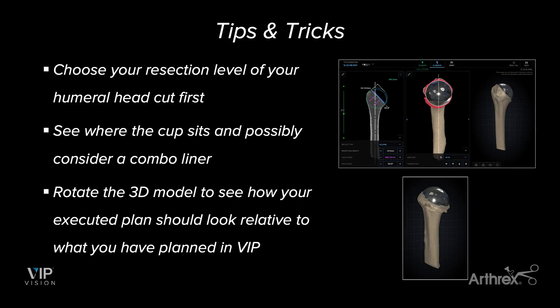Let's go over some tips and tricks on how to use humeral planning in the VIP system. I always want to take a look at the humeral head first. I personally rotate the head to the correct side of anatomy — if it's a right side, I rotate it to look like the right side; for left side, to look like the left side. I always choose the resection of my humeral head cut first. I can see the different osteophytes present, what size I need for my trunnion if I'm doing an anatomic, and what size I need for my cup if I'm doing a reverse. From there, I can rotate the model around to see what the cut looks like in 3D.